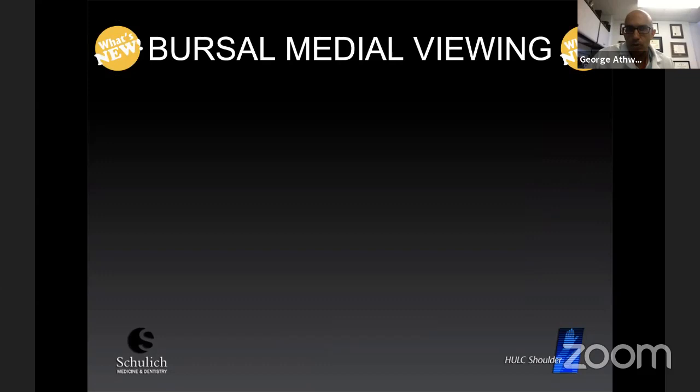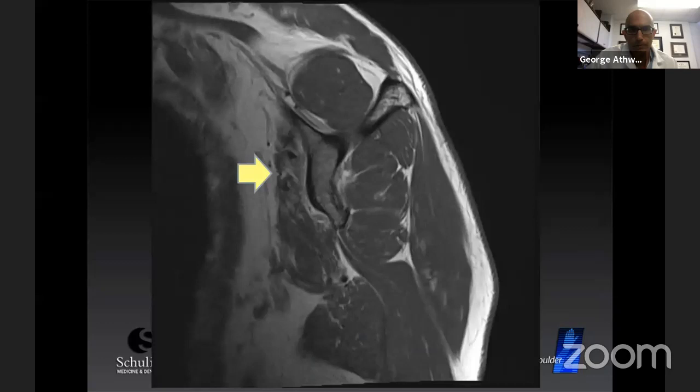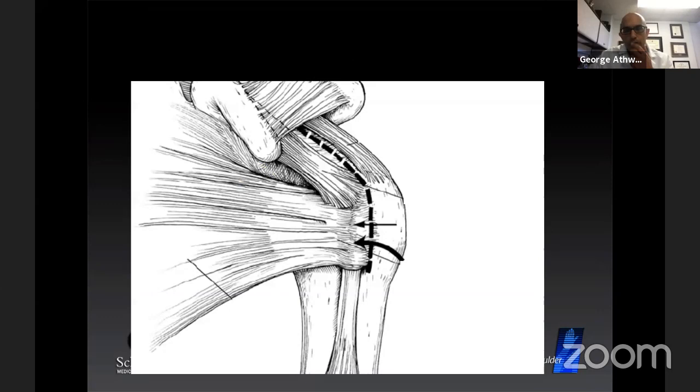delta pectoral portal. So this is a patient, no glenohumeral joint arthritis, isolated subscap tear, the supraspinatus is intact. There's the subscapularis tear. You can see there's some degree of fat infiltration, young patient though. So what we're gonna do is, this is our standard anterior portal from the front. Here's our anterolateral portal. And here is the delta pectoral portal.